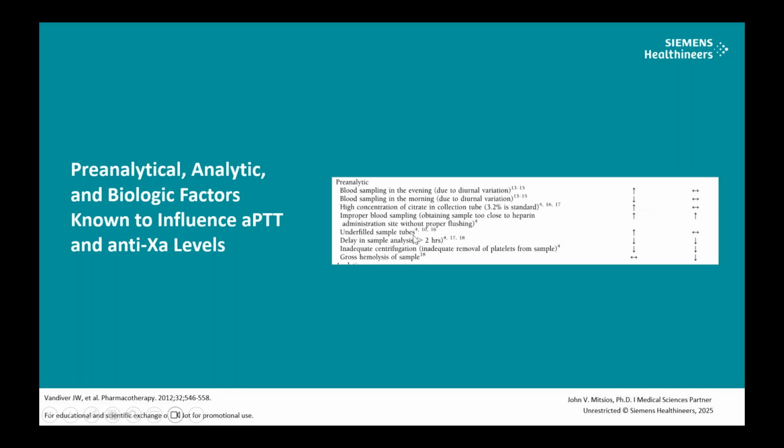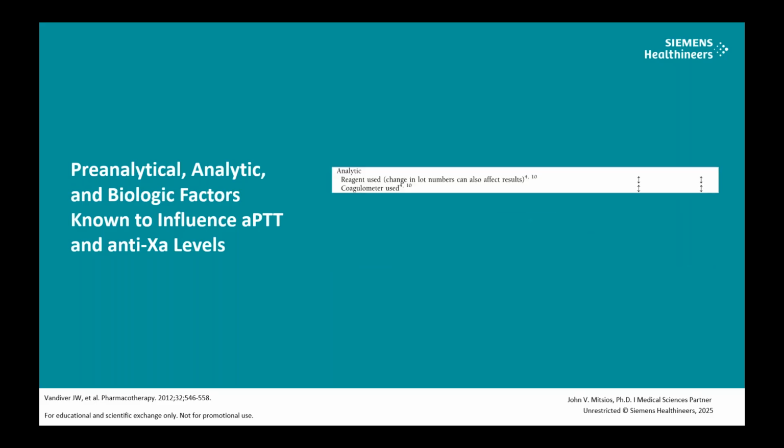Underfilled sample tubes. This is a common problem, I think, in many clinical laboratories, especially when it comes to hemostasis testing, where if we're underfilling, that means the anticoagulant to blood ratio has been severely compromised. So there's more anticoagulant, which would subsequently affect and prolong your PTT assay, and could potentially affect your heparin values. Whereas in this particular case, it's not going to be affecting your anti-10A assay. Analytically, of course, both assays are subject to analytical variations and differences.